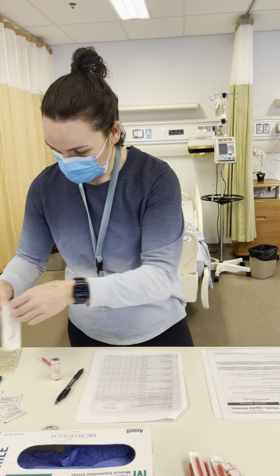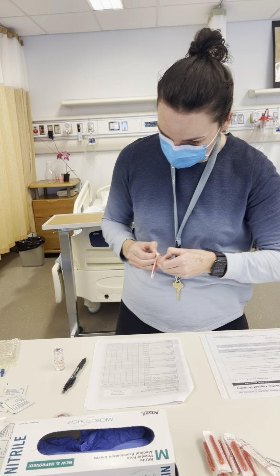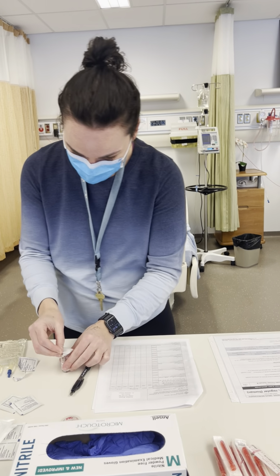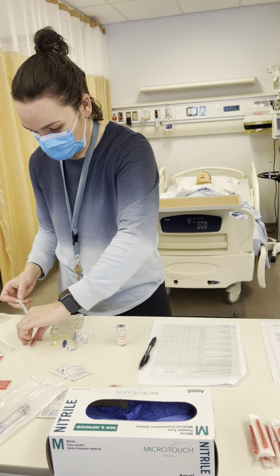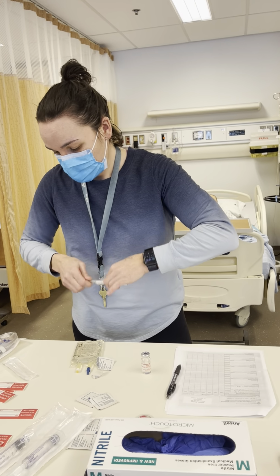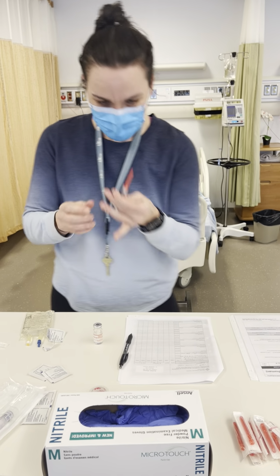So we'll open up our things here, and we'll clean our insulin. Okay, clean for 30 seconds, let dry. There we go. 1 ml.